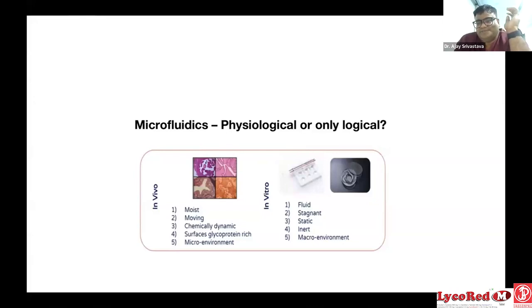I basically prefer the density gradient or swim-up only. So I cannot tell the company names. I think I have used this, and we have presented one poster at ACE also, and we found it is very good and useful in high DNA fragmentation patients. Exactly, sir. It is very easy to use. And of course, that trial was only for limited patients, only 50 patients. But I think it is useful, and people are using it, and it is coming up that you can decrease the DNA fragmentation after using this technique.